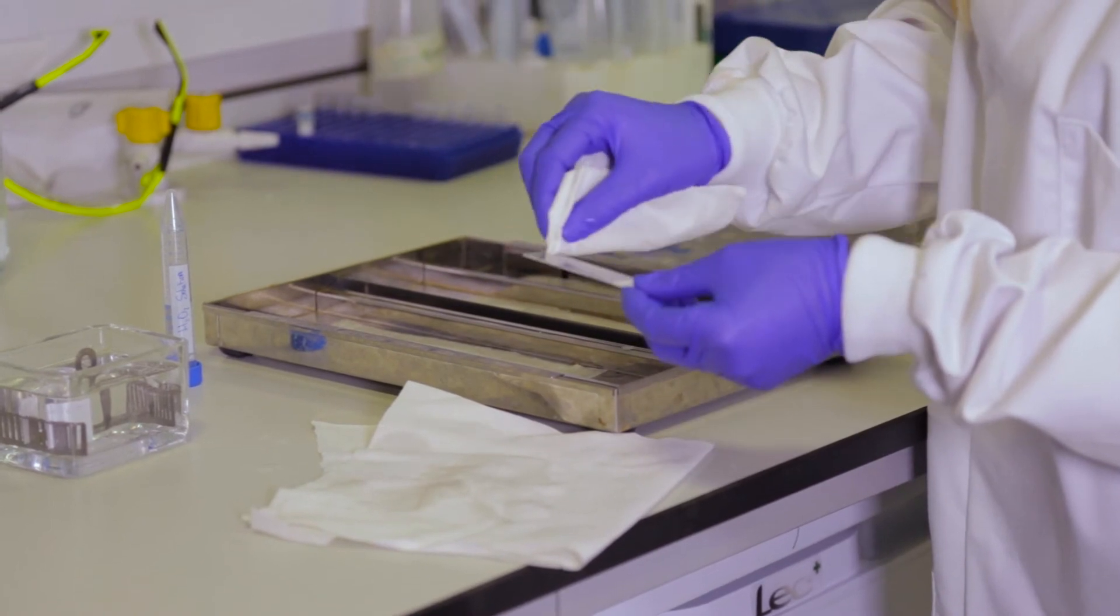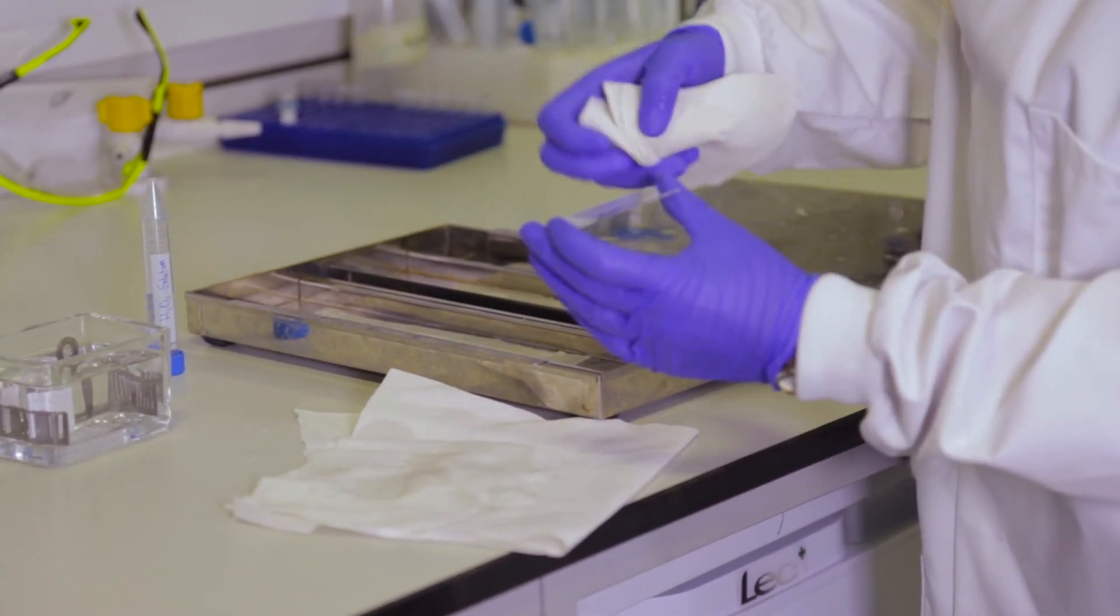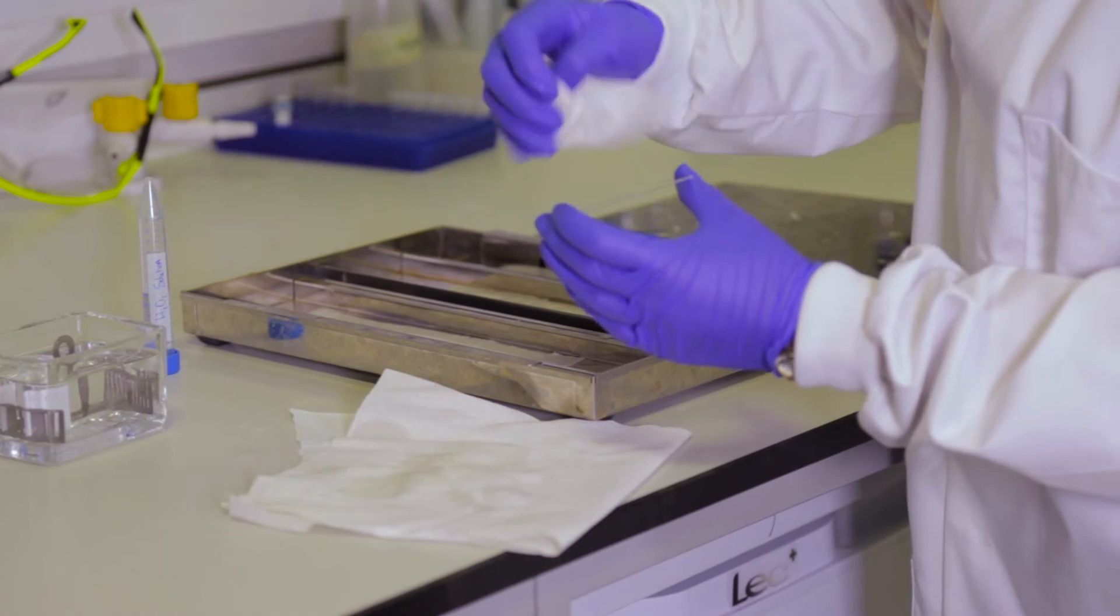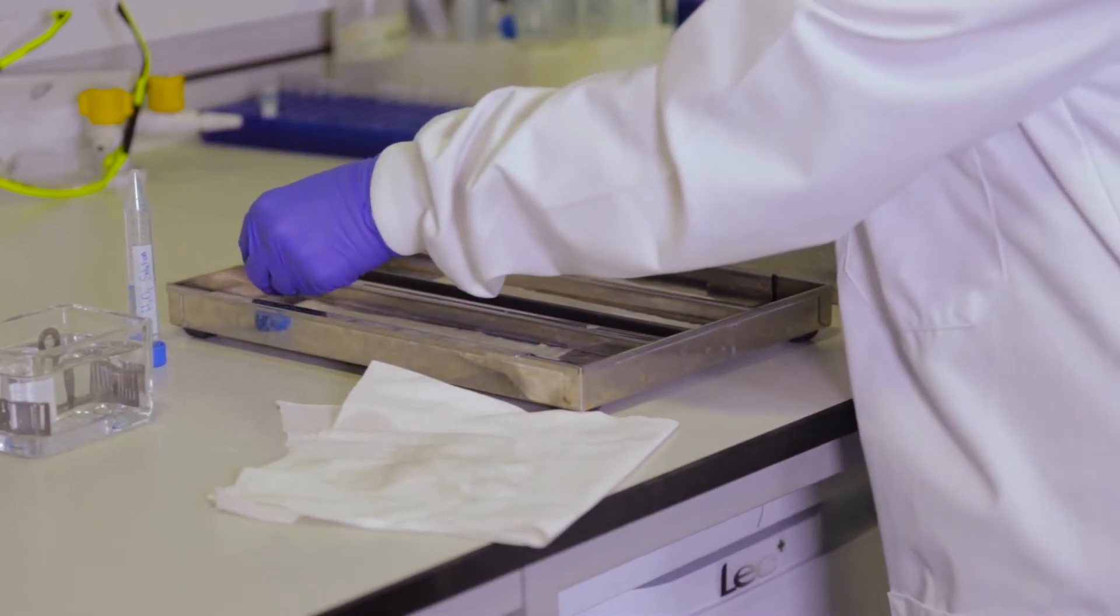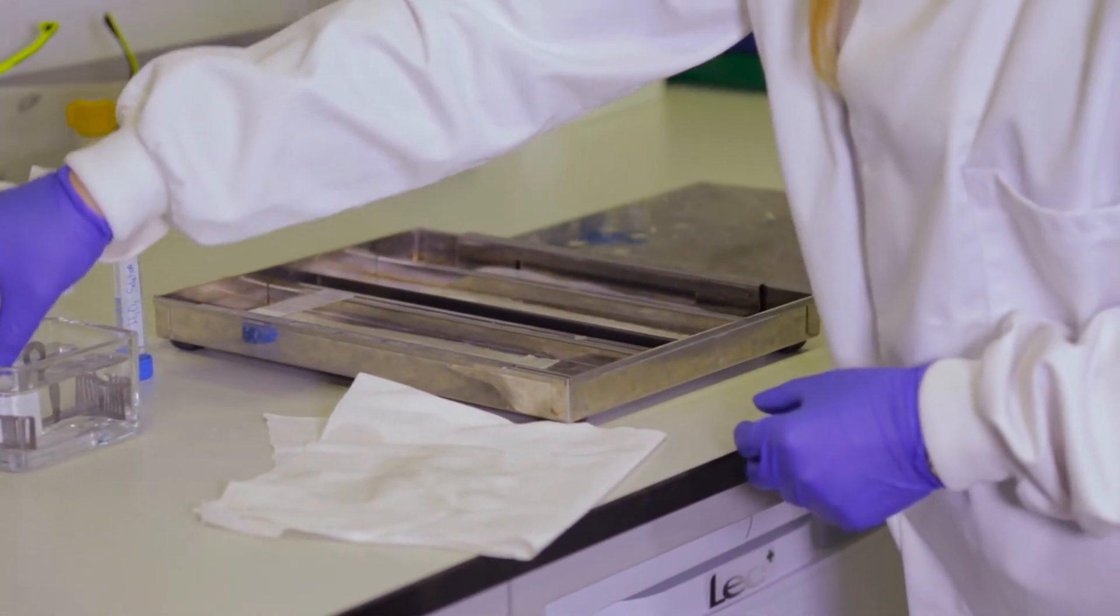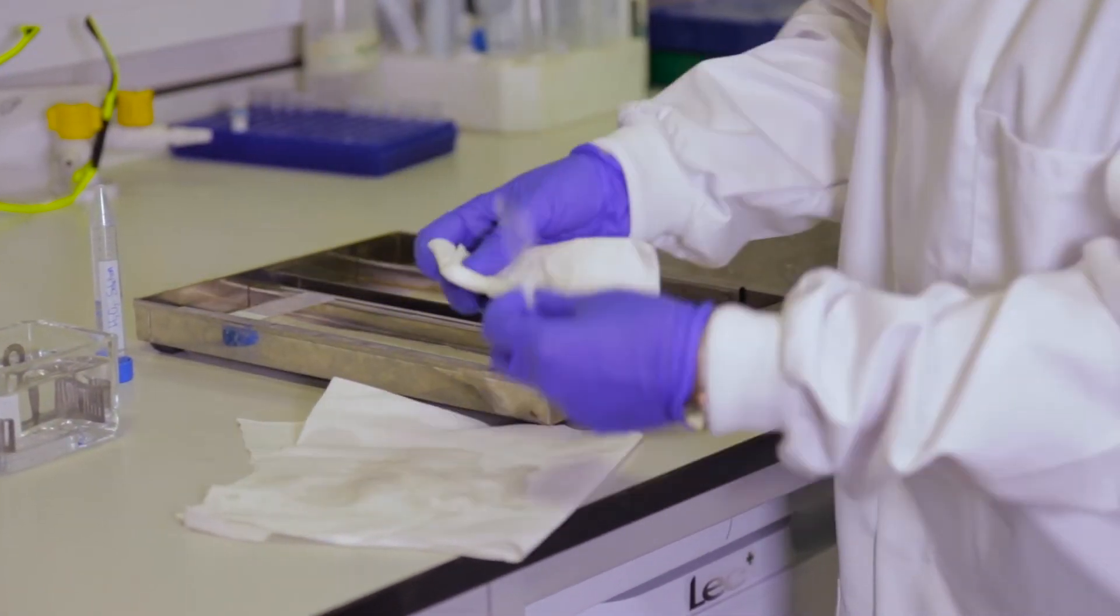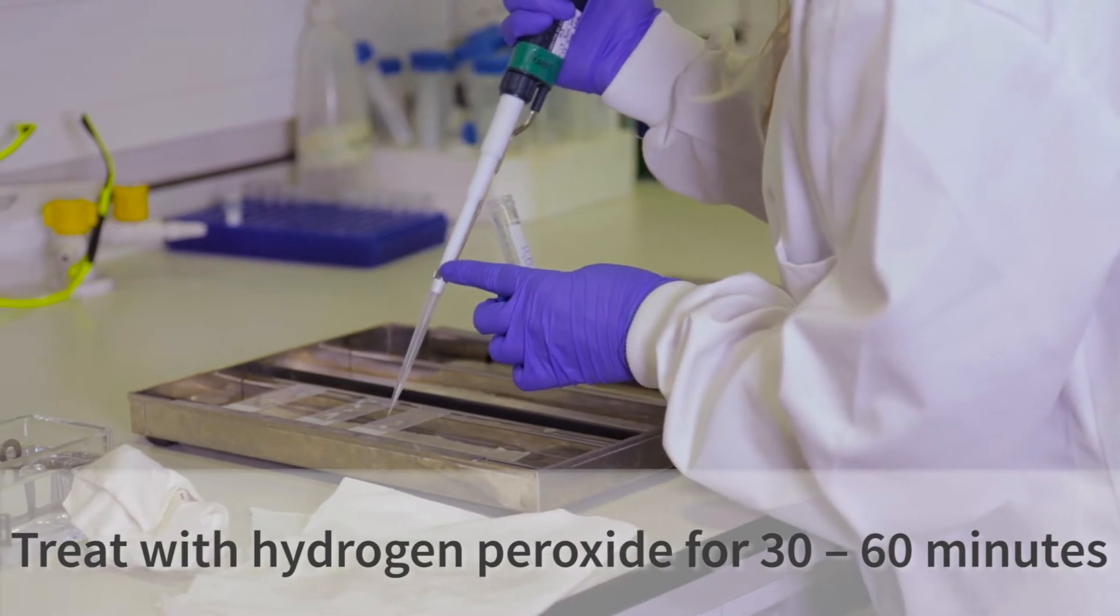The next step is to quench the endogenous peroxidase. To do this, remove the slides from the PBS and dry them on the back and the sides, ensuring not to damage the tissue on the front. After this, place them in an immunostaining tray. The tray should have some damp tissue in the bottom of it to prevent the slides from dehydrating during the protocol. You then pipette on the hydrogen peroxide solution.